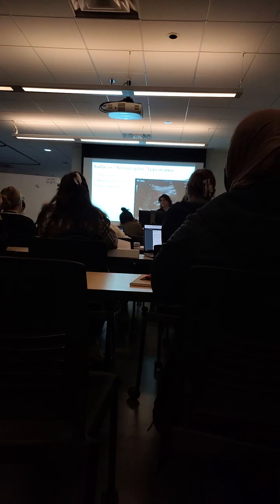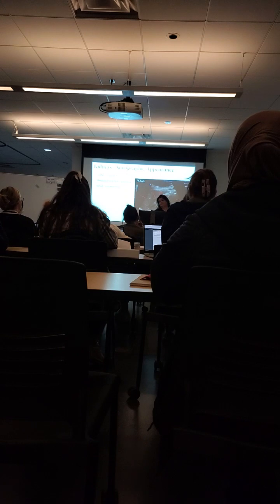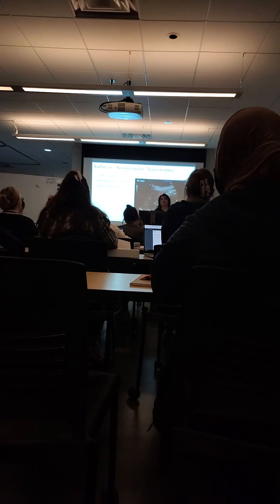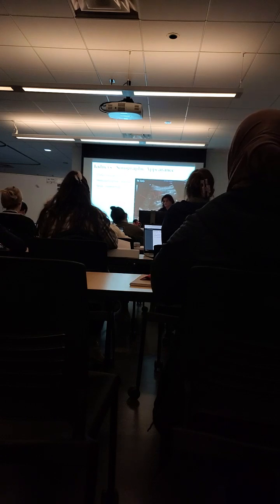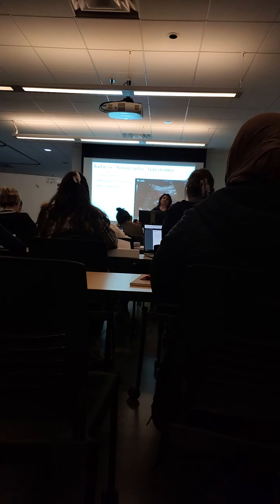And this is the measurement, by the way, if you were to measure it. This is how we measure superior to inferior, the longest length. And see how this one's labeled upper pole, lower pole? Because a lot of times when you find a stone, you're going to say in the upper pole versus inferior. Again, not wrong. It's just a preference.